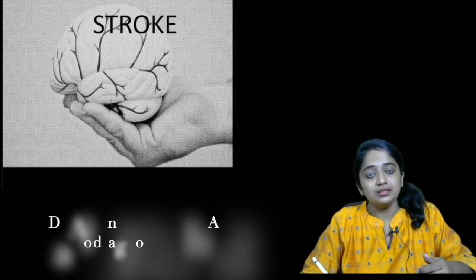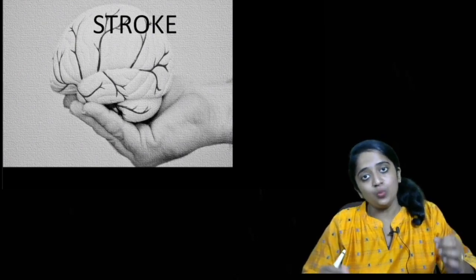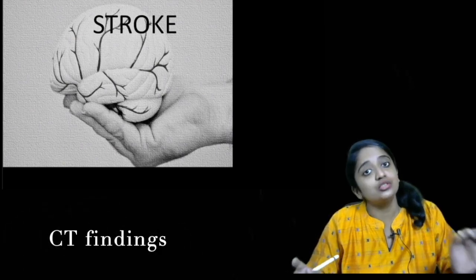Hello friends, welcome to the next lecture in the stroke imaging series. In this lecture, we shall discuss the role of imaging and the CT findings in infarct, ischemic stroke.